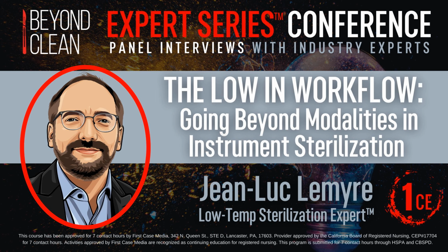Yeah, that's really interesting. It's kind of weird thinking about there being ice in a chamber for a cycle that's going to get up to 130 degrees, right? So that's really interesting to think about. And it's very localized. It's just at the point where the droplet is, but depending on the amount, it could be too much. And peroxide condensing will do the other thing I mentioned earlier. It will prevent it from being available to do its job.